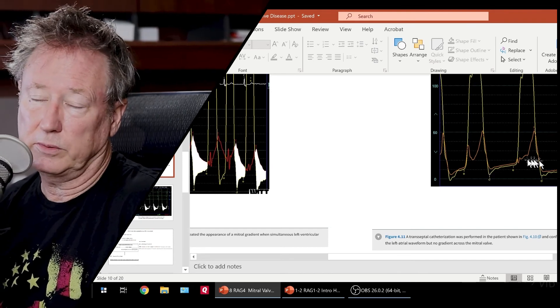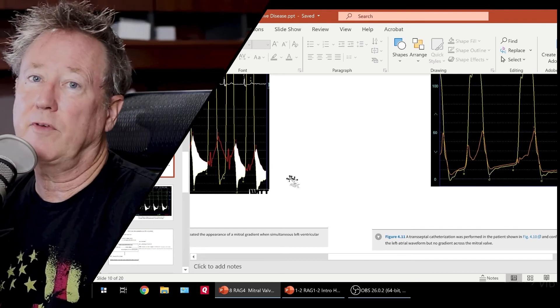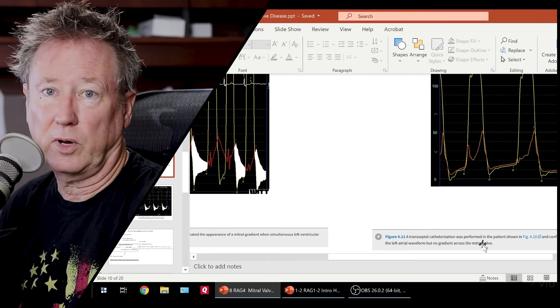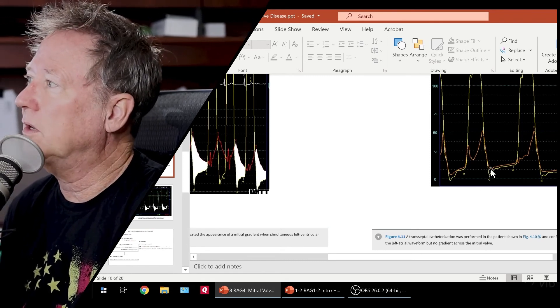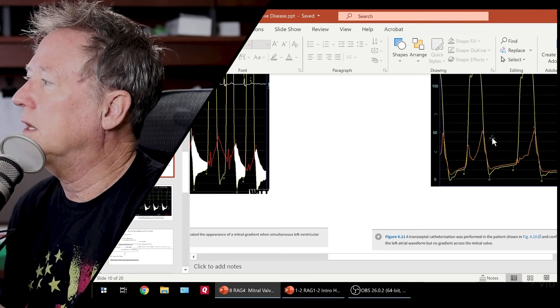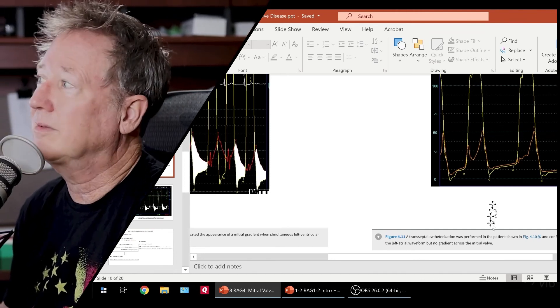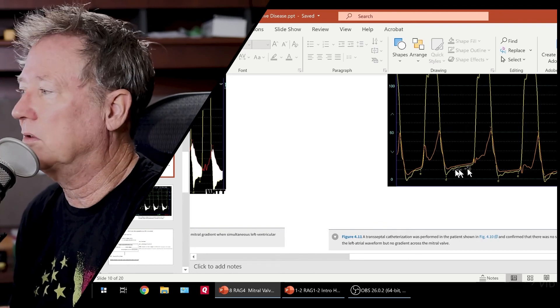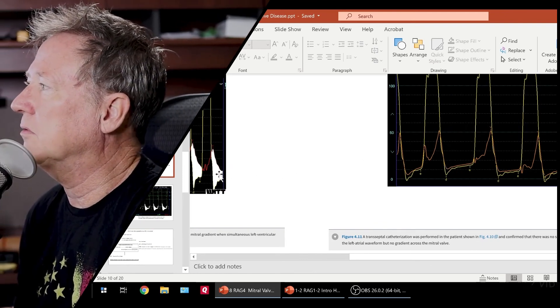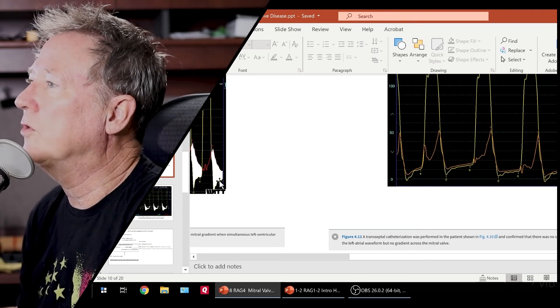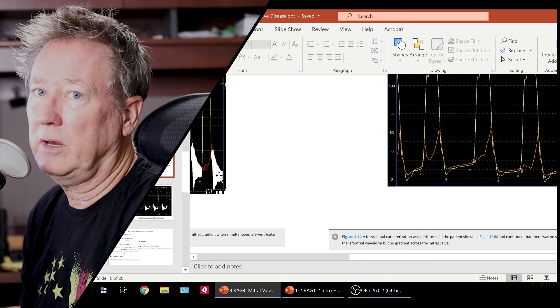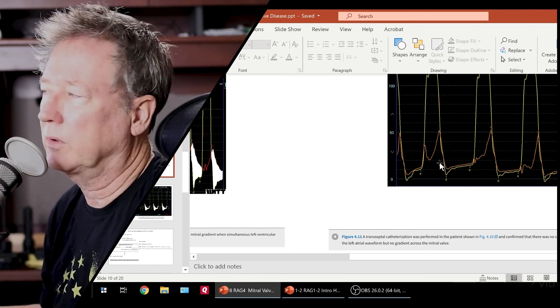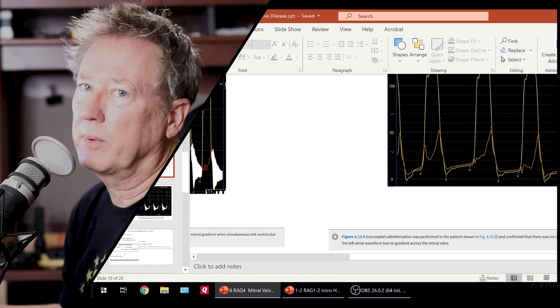If you're considering a valve replacement — major surgery with your chest open — you absolutely need to make sure that your pressure gradients are accurate. Here, while there is a large V wave, it shows that there is no significant mitral stenosis — there's no gradient. Something else is causing this large V wave, not mitral stenosis in this particular example. The numbers are about the same, and it's from a textbook. As initially you might have thought there was a gradient, but after phase correction it becomes clear there isn't.